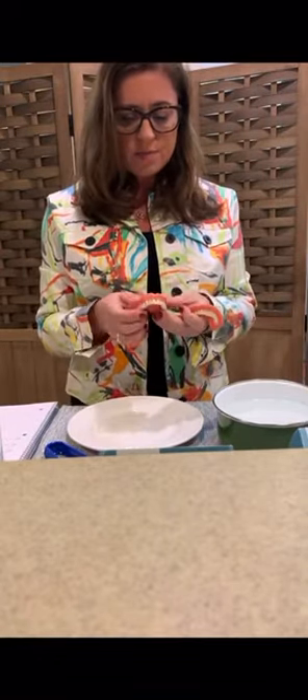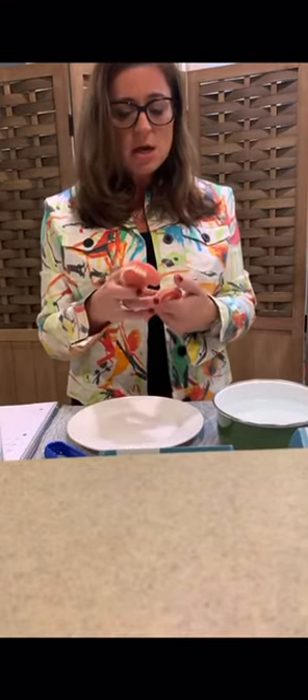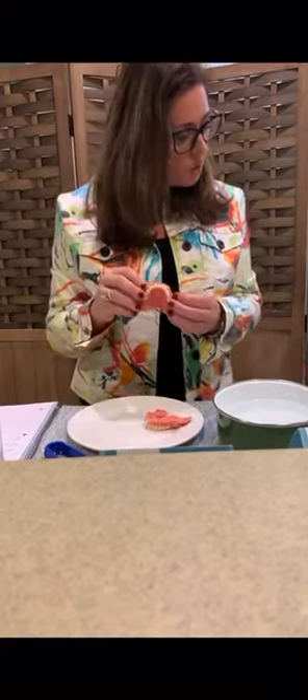If you want to have a demo yourself in your office, or you want to see this, contact your friendly Benco representative. Easy Denture comes in one shade and one shade only: B1.